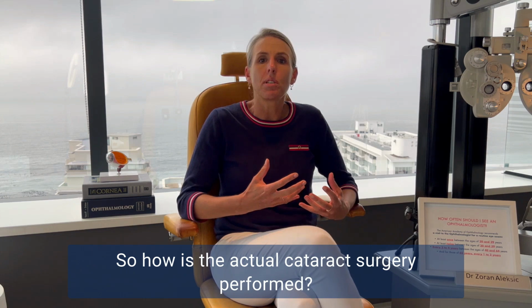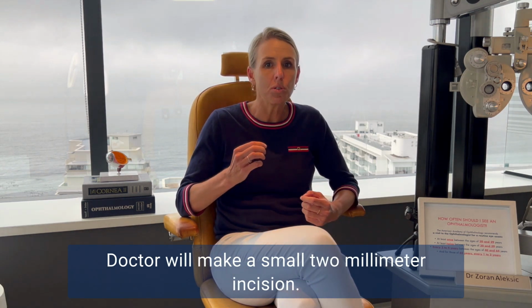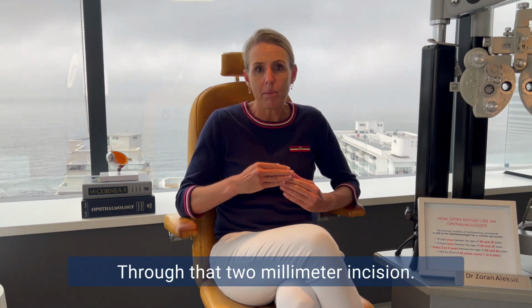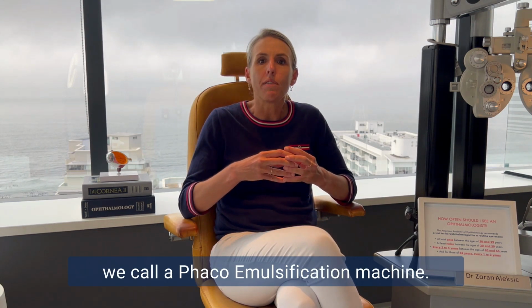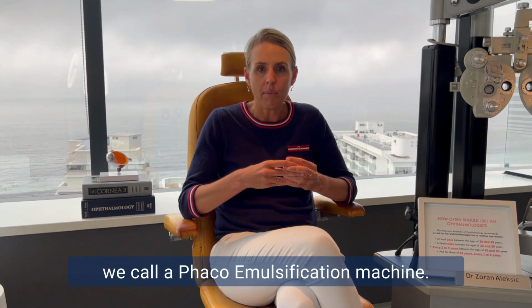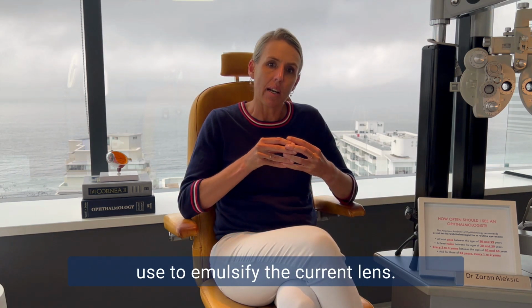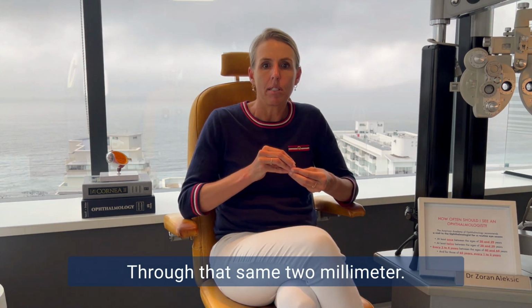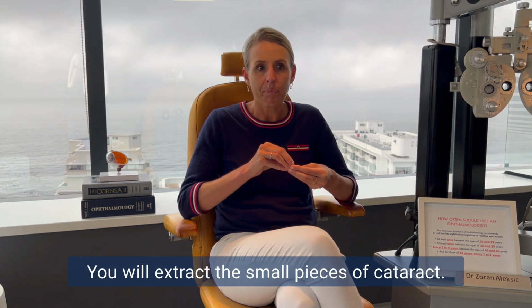So how is the actual cataract surgery performed? Doctor will make a small 2 mm incision on the side of the eye. Through that 2 mm incision, he will go in with what we call a phacoemulsification machine. That is an ultrasound that he will use to emulsify the current lens that is now the cataract. Through that same 2 mm incision, he will extract the small pieces of cataract.